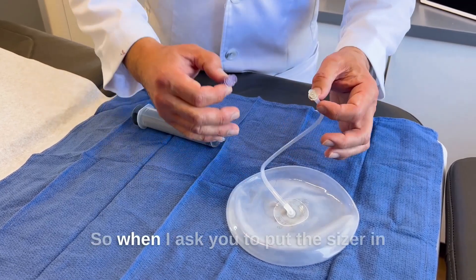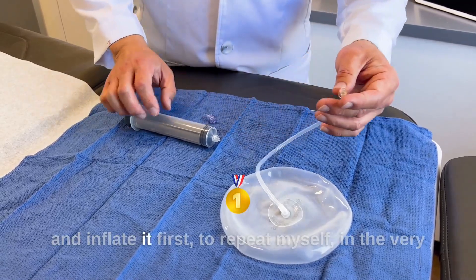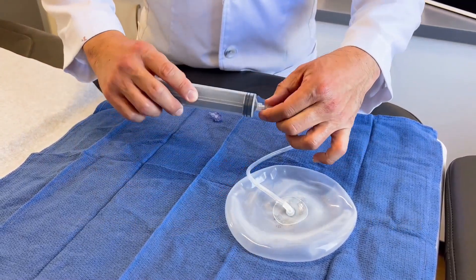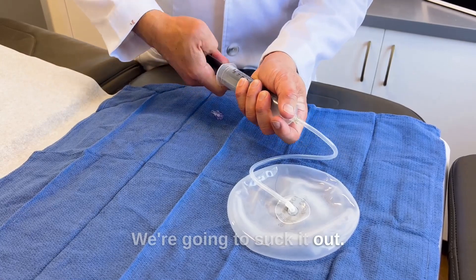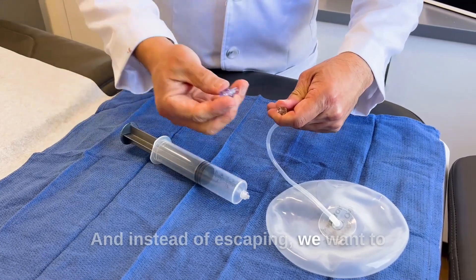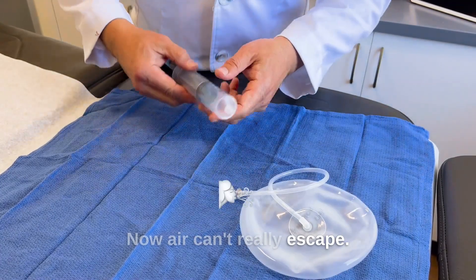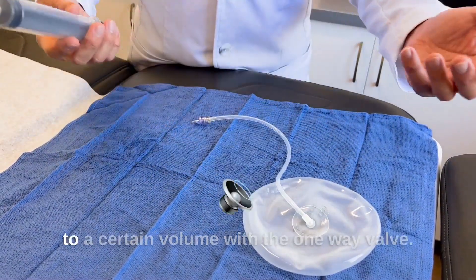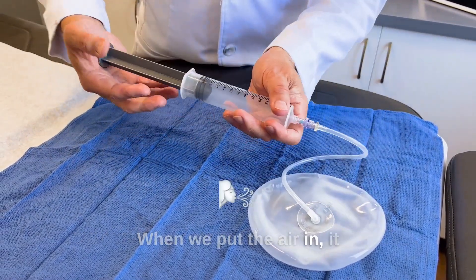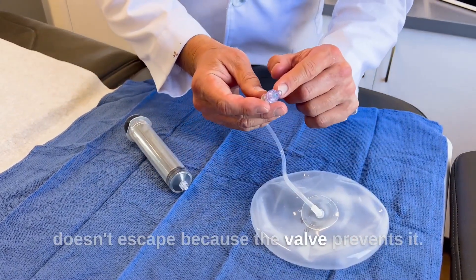I hope this clarifies things. So when I ask you to put the sizer in and inflate it first — to repeat myself from the very beginning — we want to remove all the air from here, we're going to suck it out, no air, and instead of escaping, we want to put the one-way valve on. Now air can't really escape. I will ask you to fill this sizer with air to a certain volume, and with the one-way valve, when we put the air in, it doesn't escape because the valve prevents it.